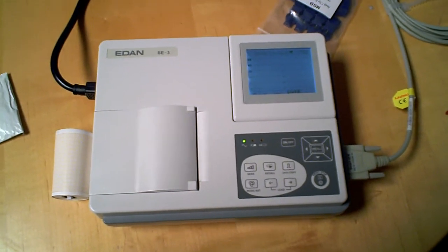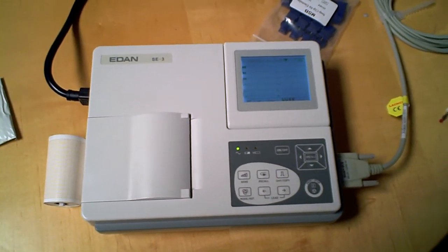That concludes the EDEN SE3 EKG training.